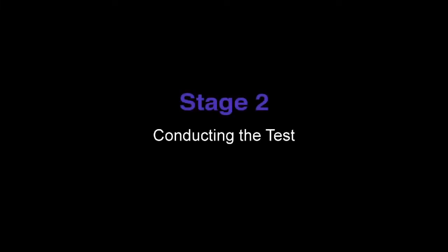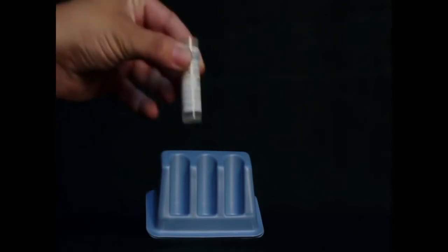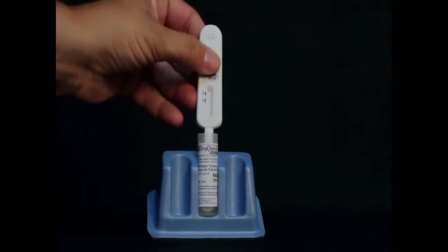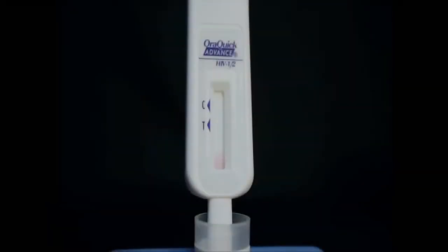Stage 2: Conducting the test. Insert the flat pad of the test device all the way into the vial. Make sure that the flat pad touches the bottom of the vial. The result window on the device should be facing toward you. Start timing the test. Do not remove the device from the vial while the test is running. Pink fluid will appear and travel up the result window and will gradually disappear as the test develops.